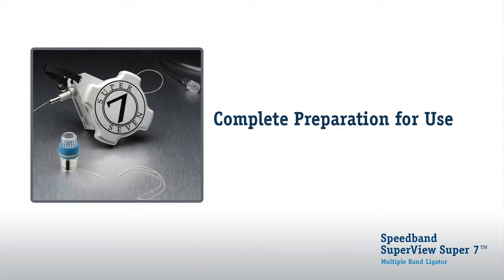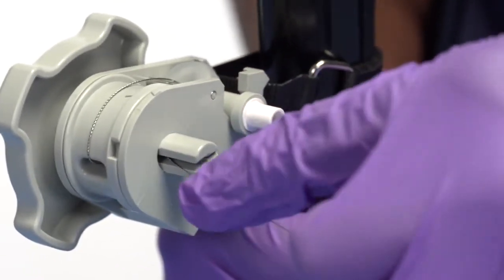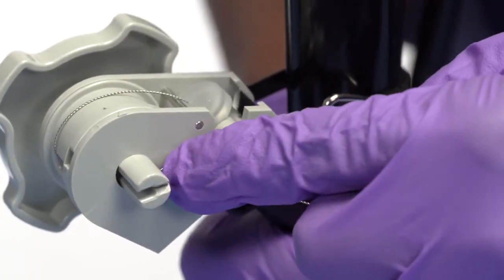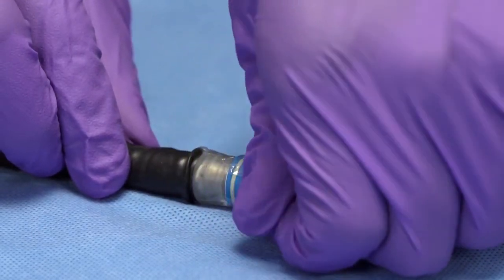Complete preparation for use. Grasp the tripwire and retract to remove the slack. Then lock down by pulling across the narrow slot. Do not over tighten. Carefully remove the shrink wrap by hand.